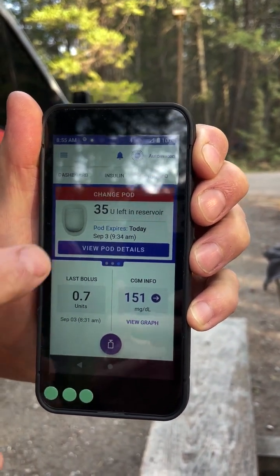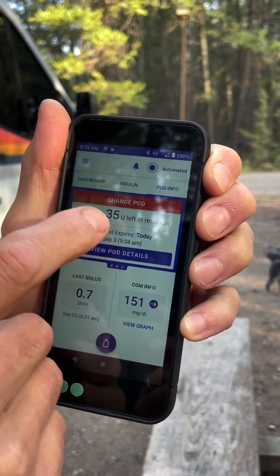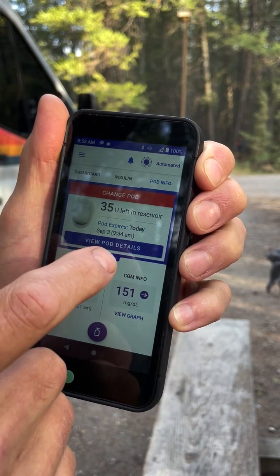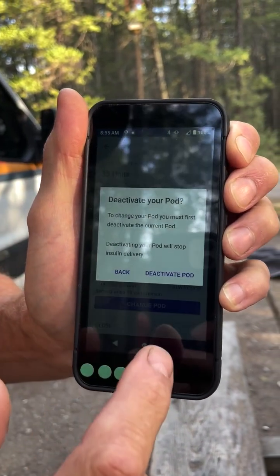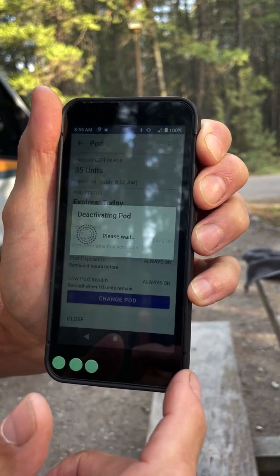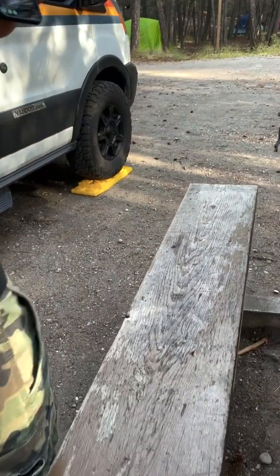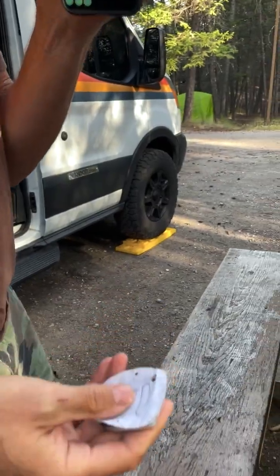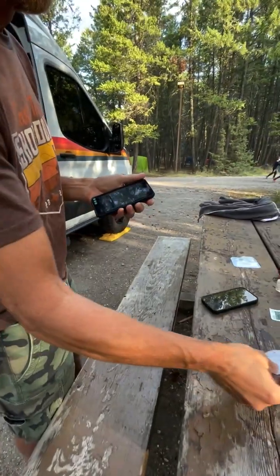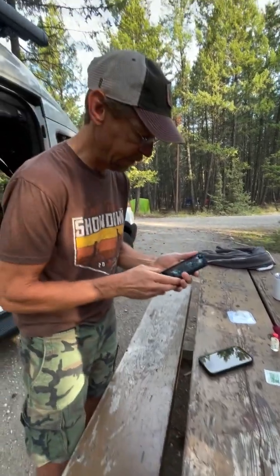But it's time to change this pod out. So I'm going to change the pod — pod info, view pod details, change pod, deactivate pod. It's deactivating the pod that is on my back right here. That's deactivated. I'm going to take that guy off. They come off pretty easy, though sometimes I get knocked off unintentionally, unfortunately.